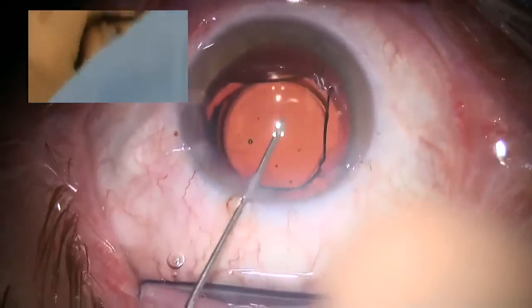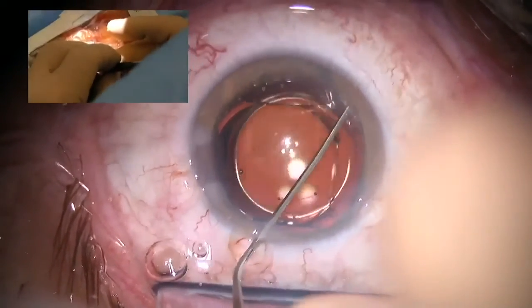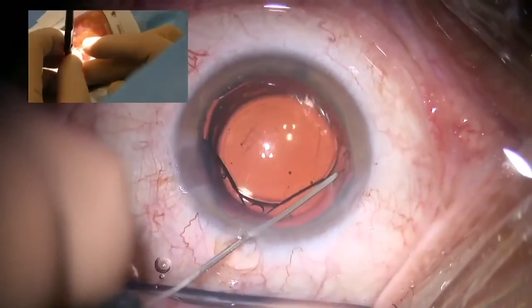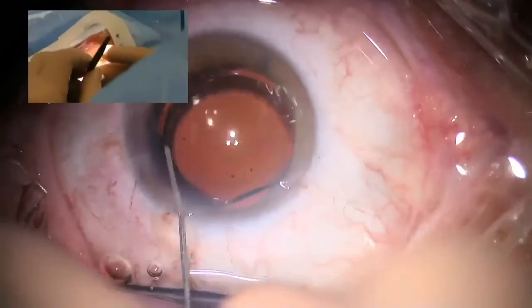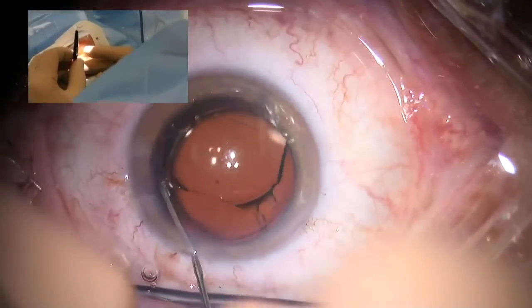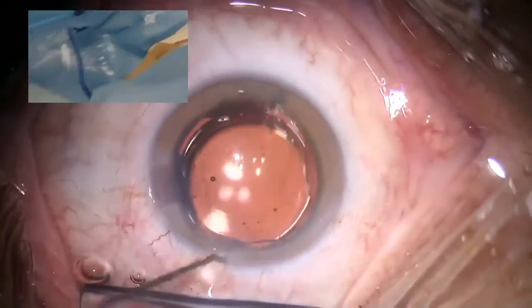The only thing you have to be crucial about is the fact that the haptics must not be underneath the rexis. Centration.